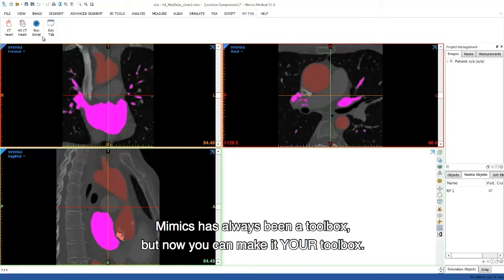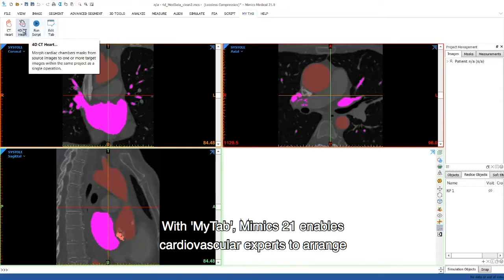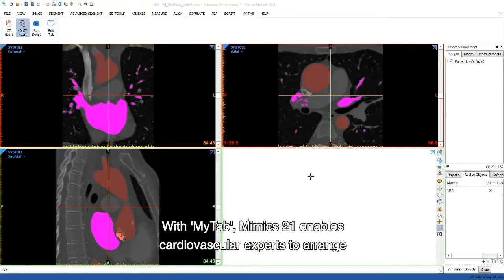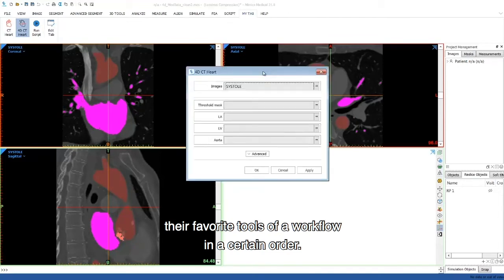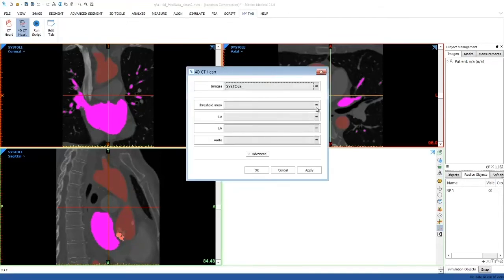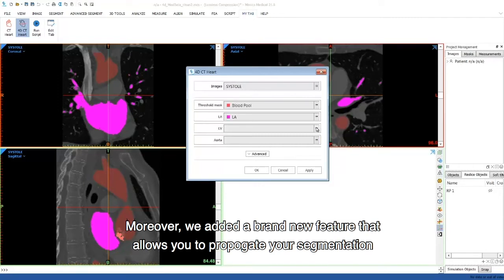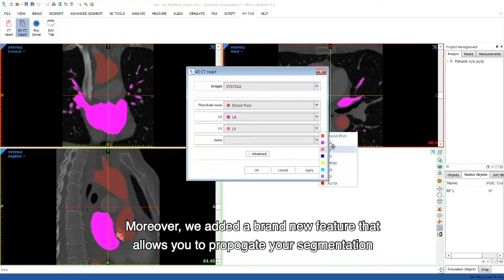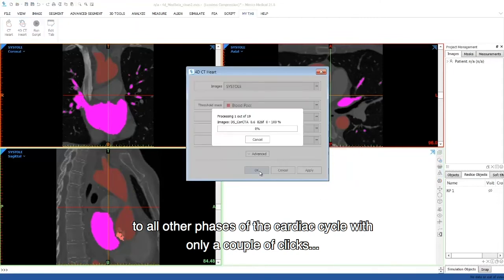Mimics has always been a toolbox, but now you can make it your toolbox. With MyTab, Mimics 21 enables cardiovascular experts to arrange their favorite tools of a workflow in a certain order. We added a brand new feature that allows you to propagate your segmentation to all other phases of the cardiac cycle with only a couple of clicks.